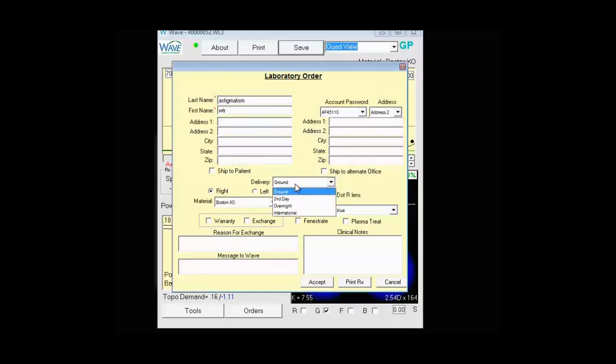You can select your delivery method. You can specify if it's a right or a left lens. This is where you also choose your lens material from the wide amount of choices we have. Based upon your lens material, you can select the lens color. You can choose whether or not to dot the right lens, fenestrate, or plasma treat.